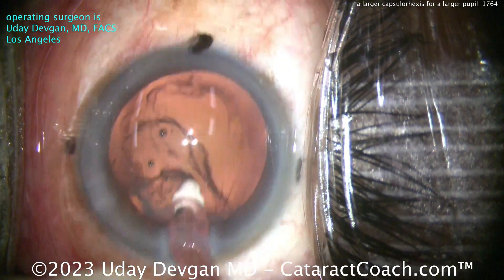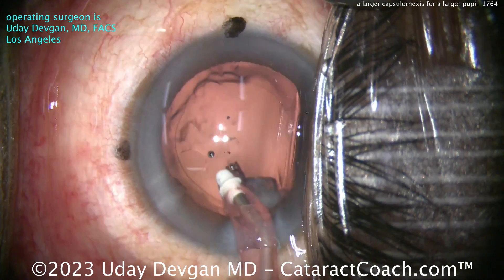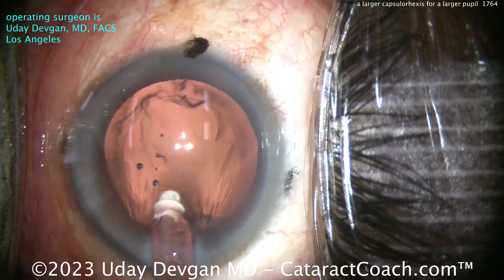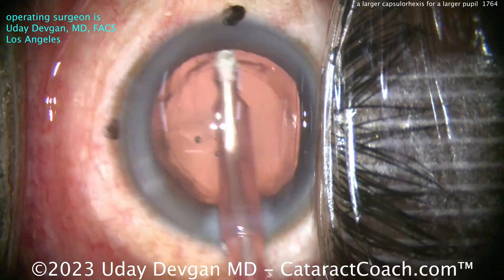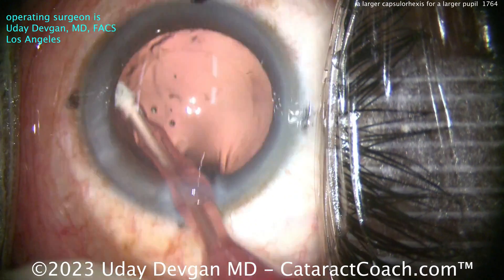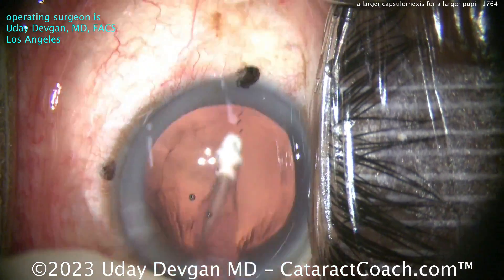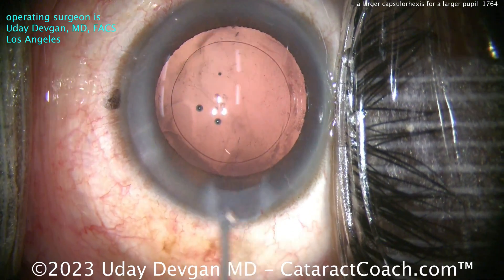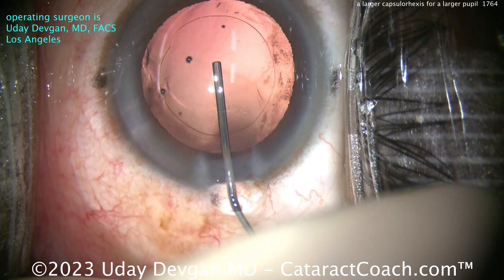So how do you get it so centered up and how do you get the rhexis the right size? Obviously, like anything else, it's just practice. But I think using forceps that are marked really does make a big difference. You don't have to buy any particular forceps — you can actually mark your own. An ink mark is not going to stay on them, but you can use a disposable steel keratome and score them, making scratches at two and a half and five millimeters from the tip of your forceps. That should make a little groove there. Obviously it'll damage that keratome, but it's a disposable blade anyway.